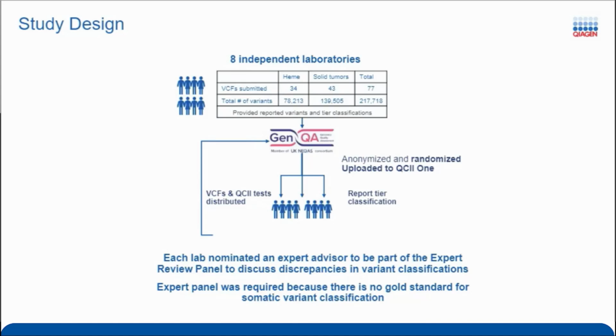Yeah, absolutely. Richard, you make a great point about the software needing to make decisions on where those appropriate thresholds are and where the cutoff should be drawn. Ultimately it is a binary output: something is in the VCF or it is not, but it all depends on where you draw the line. When we were setting up this study, we were trying to keep it unified across the group.